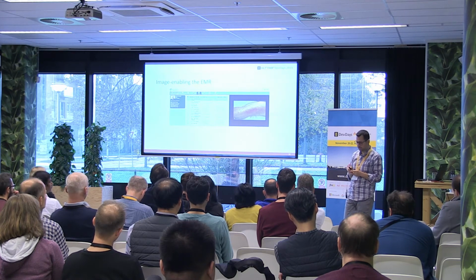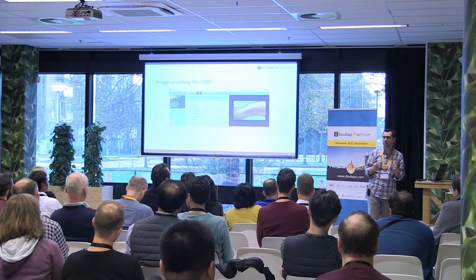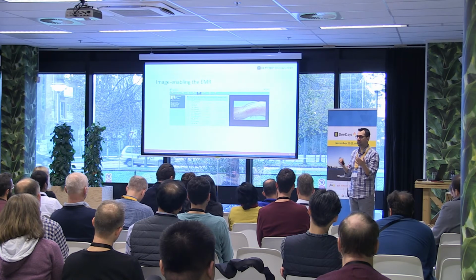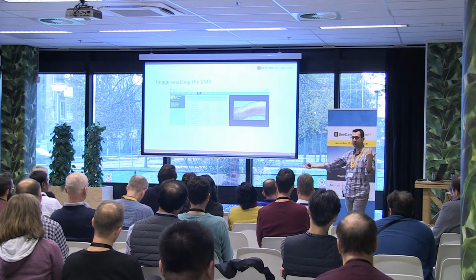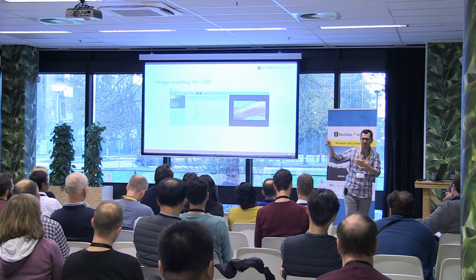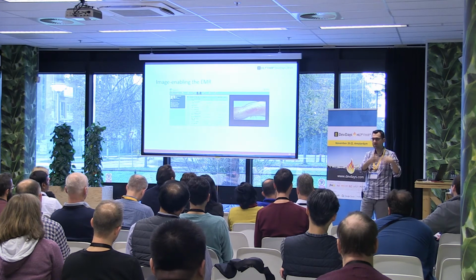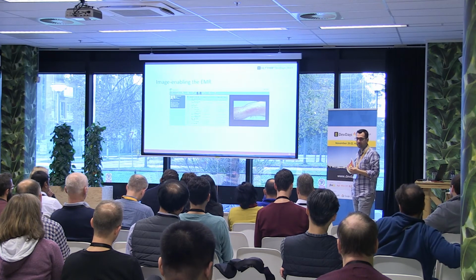Now again, showing an image all depends 100% on who your target audience is, right? Think of the example of a radiologist on one hand versus your referring physician that is looking at the report and an image. That referring physician may not necessarily be too concerned about seeing it in a proper viewer, but the radiologist or somebody who is maybe the specialist would want it in a proper viewer.